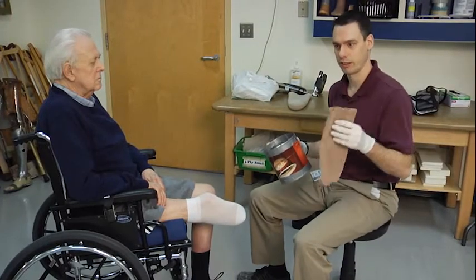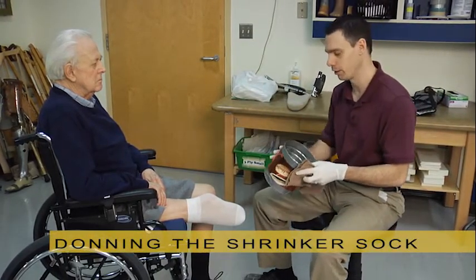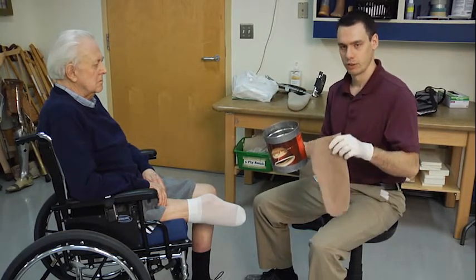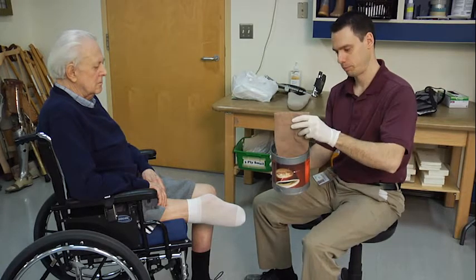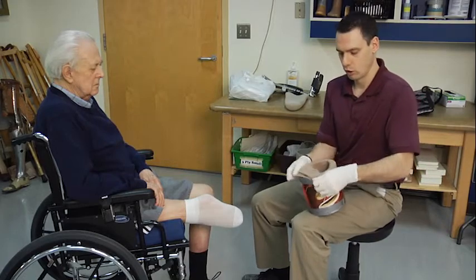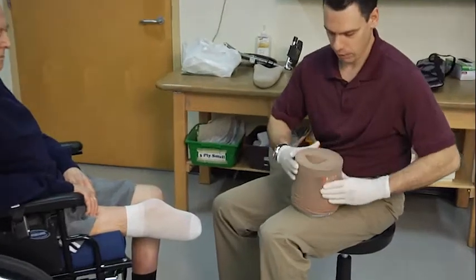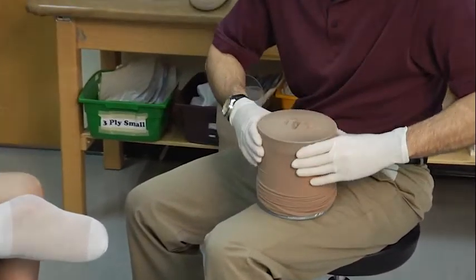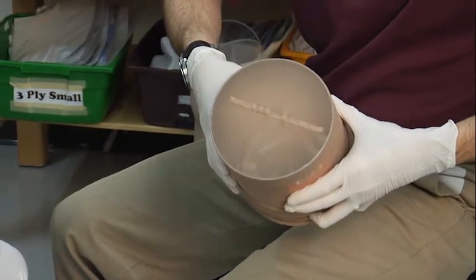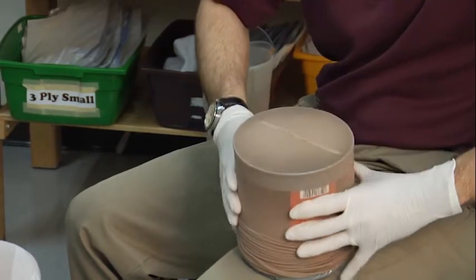Next, I'm going to take our shrinker sock. If the patient is still very sensitive, which most of them are, I'm going to use this coffee can to help don the shrinker sock. I'm first going to take the shrinker sock, put it into the coffee can, then reflect the sock over the coffee can and pull it so it's nice and tight. We want to make sure we eliminate as many creases as possible. When they're brand new it's going to be tough to get them completely flat, but do the best that you can.